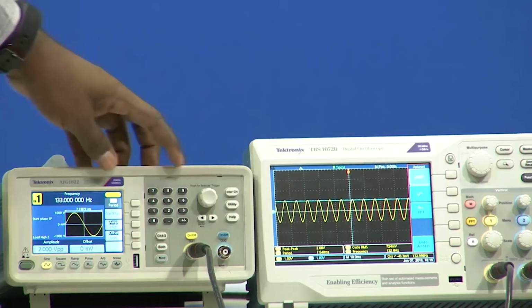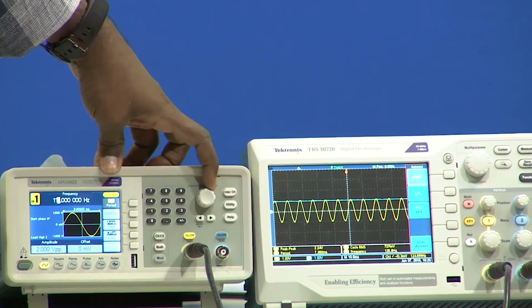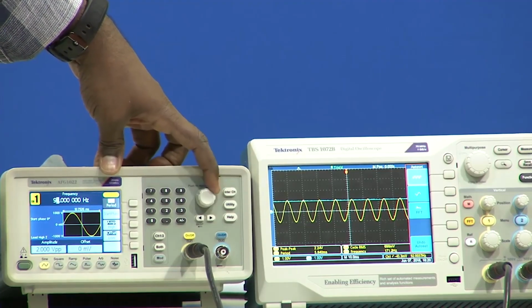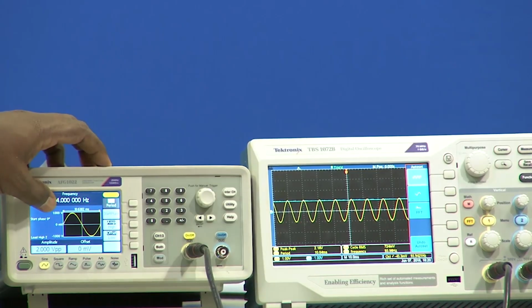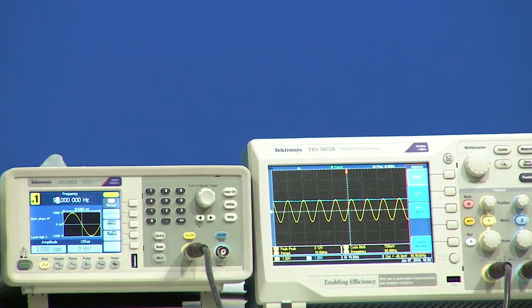Now, what if I change the frequency? It remains the same. What if I change my amplitude, right. So now let me increase the amplitude value. Right now it is the peak value of 1 volt, because we are applying an amplitude of 2 volts peak to peak, 1 volt on the positive peak and 1 volt on the negative peak.